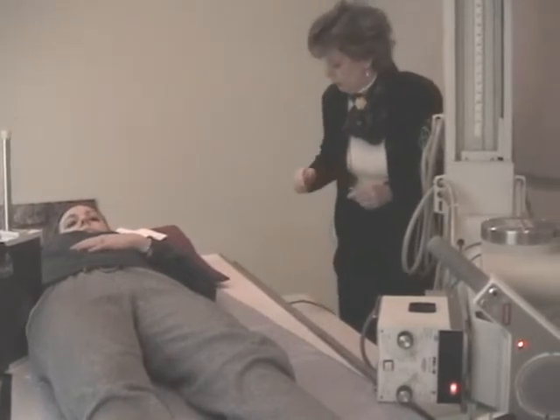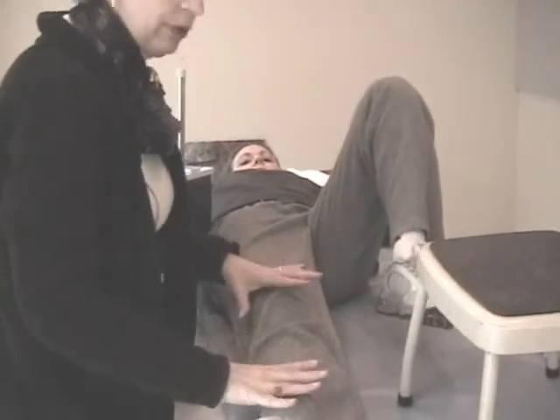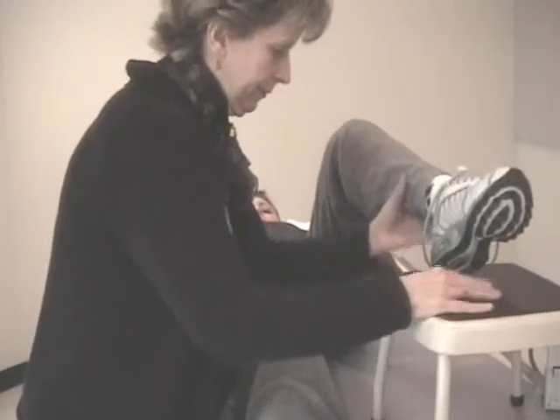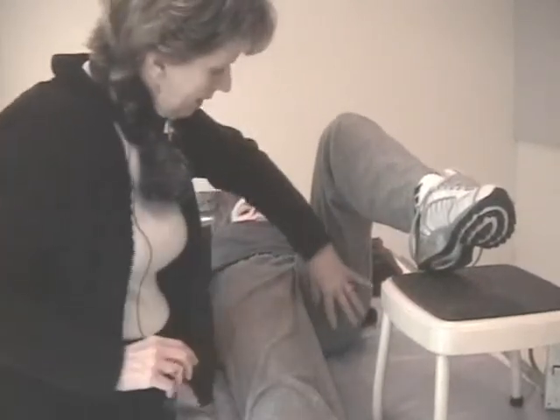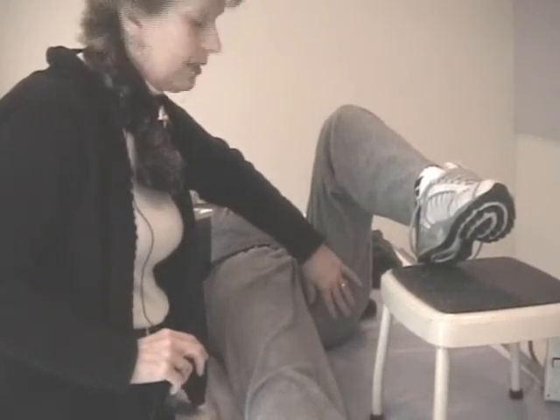Now we need to work on our patient a little bit. You're going to want to get some kind of apparatus, a portable step stool, garbage can, a rolling stool, a chair, and you don't hit the injured leg. The injured leg does not get bumped, does not get moved at all. The unaffected leg needs to be elevated as much as it can. You're trying to get the gluteal fold up and out of the way. I think the camera can see this.